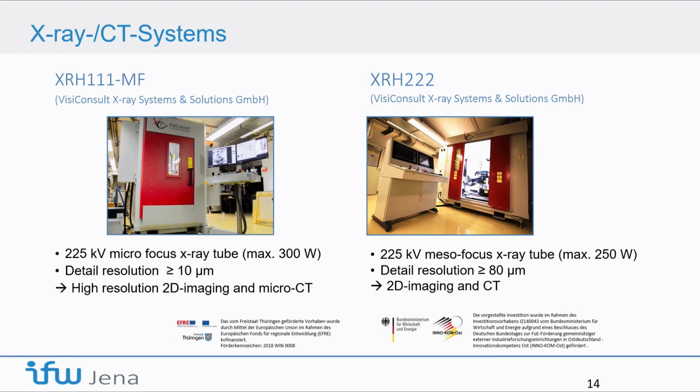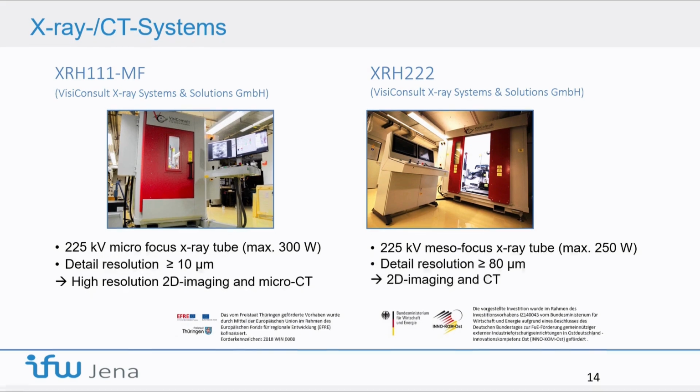On the right side, this is the older system. There's a third X-ray tube in it to get deeper in the material, to get higher resolution, to get the pores in a smaller range. So you have to keep investing in this to stay ahead also in additive manufacturing.